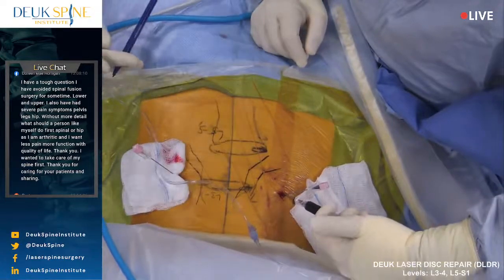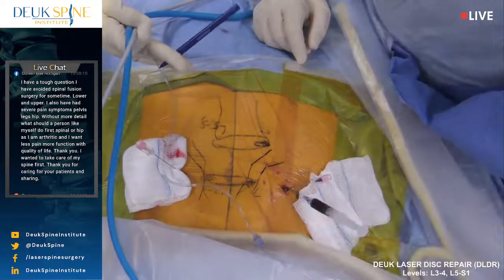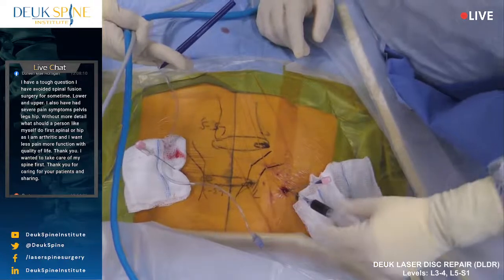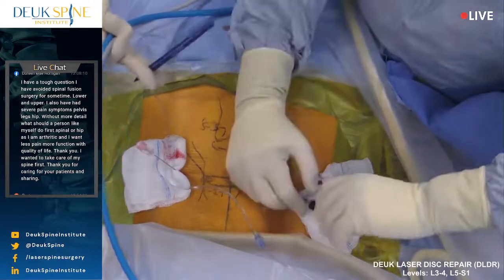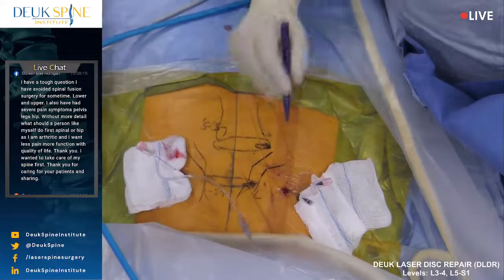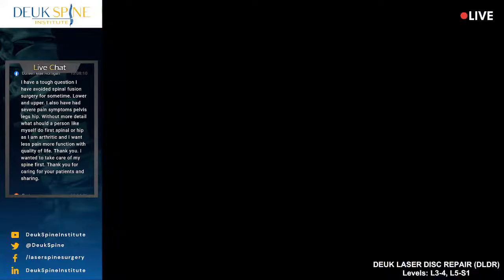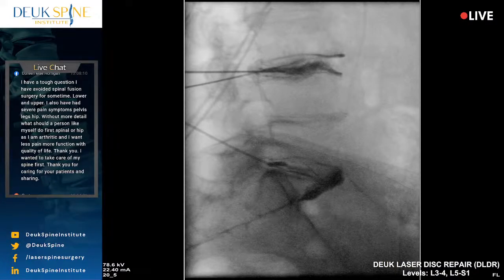It's a pressure. How bad is that on a scale of 1 to 10? How bad is that? 9? 9 over 10, okay? That was L5-S1. Is that where you get your back pain? Yeah. All right, so both of these discs were concordant. Okay, you get to go to sleep now. Go ahead and count from 1 to 100. When you wake up, we'll be done. Count out loud for us from 1 to 100.